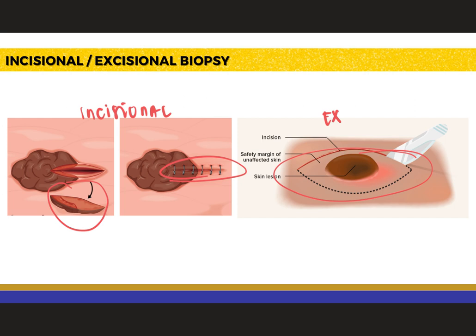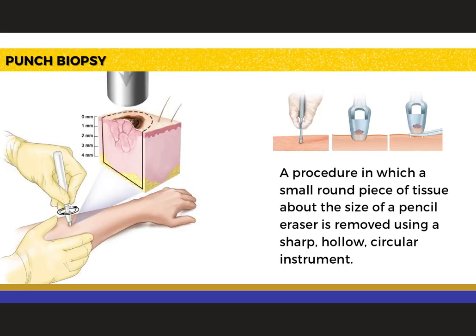Okay? Now going to punch biopsy. Punch biopsy is considered the primary technique for obtaining a diagnostic full thickness skin specimen.